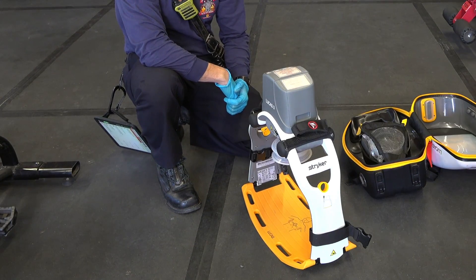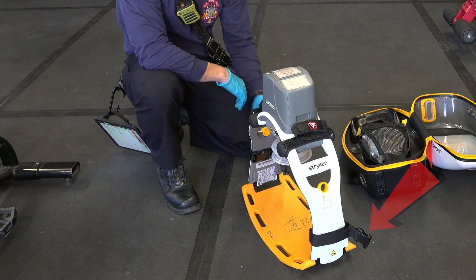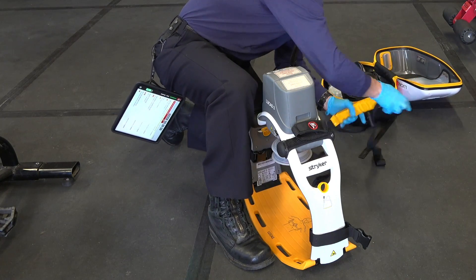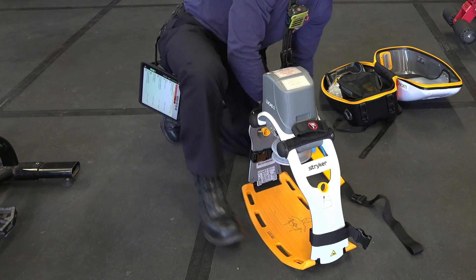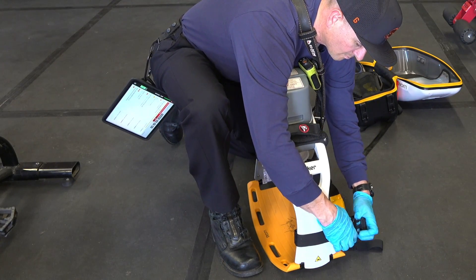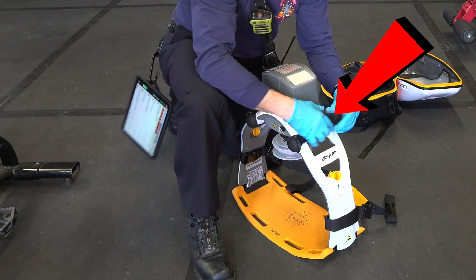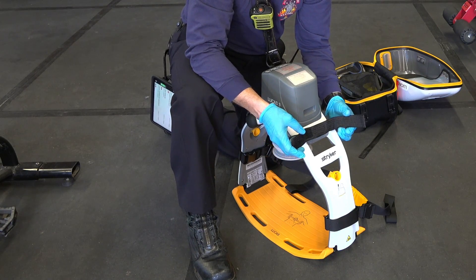A couple other things to notice: the attachments for the shoulder strap are low on the device, and they clip into these attachments on the bottom. When you're ready to attach the shoulder strap, you attach it on one side, pass it underneath the patient's neck, then attach it on the other side and pull it tight. And finally, there are straps up near the battery where you can place the patient's wrists so that their arms are up, out of the way, and not flopping down on the gurney.